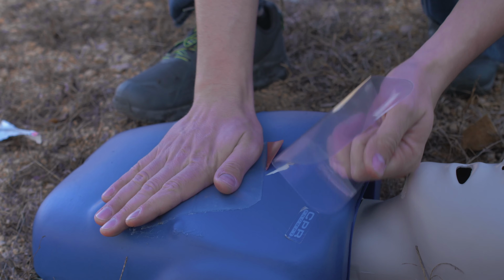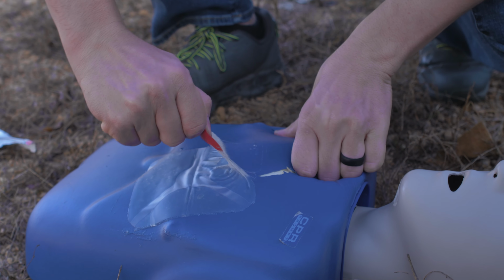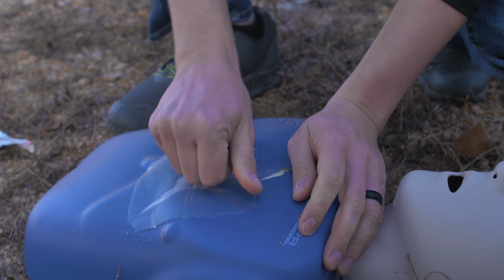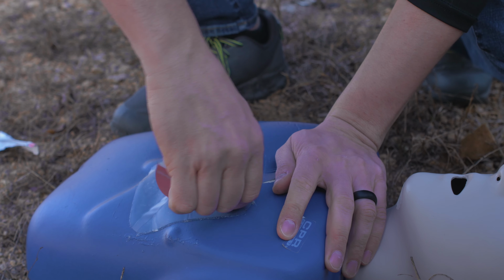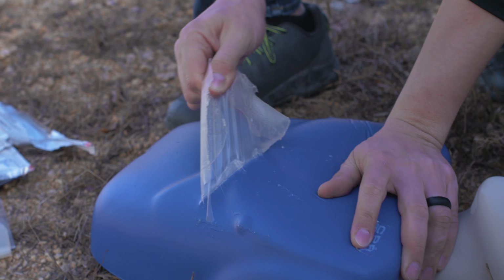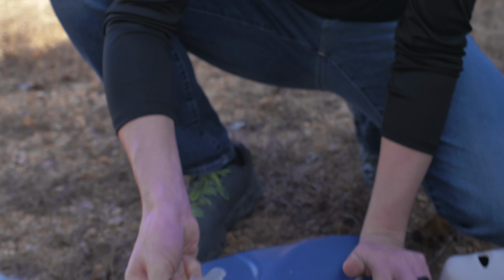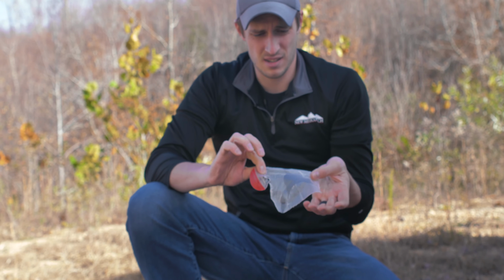Sticks just fine, still warm. And appears to stick just as well as the other. So sticking quite well. Of the ones that were 2 years old, that actually seemed to stick the best.